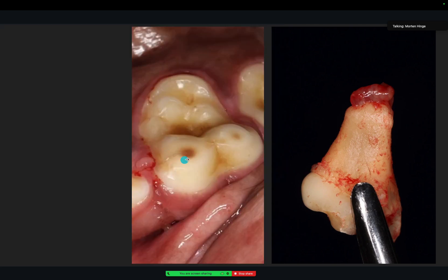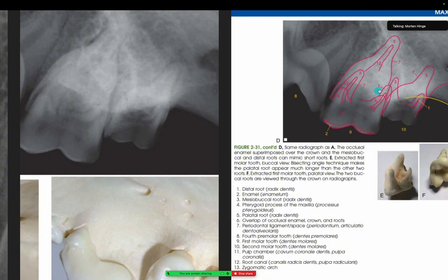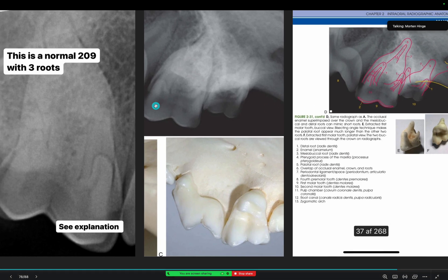Always examine the mouth when you can. That first molar is always very tricky to evaluate — it looks like it has about eight roots. But these structures are completely normal. If you look at this book — I'll show you in a little bit — these structures are normal, it's supposed to look like this. You can study that a little bit. These are all grooves overlapping each other, and it makes it look like it has a hundred roots.